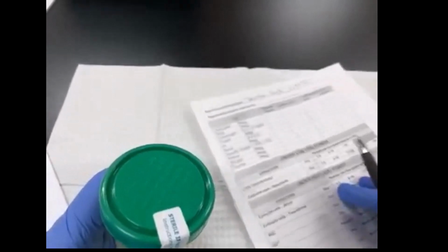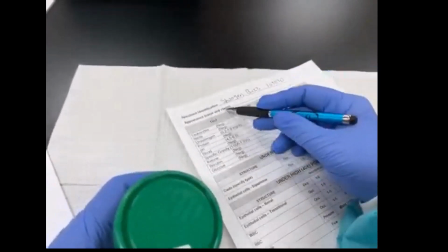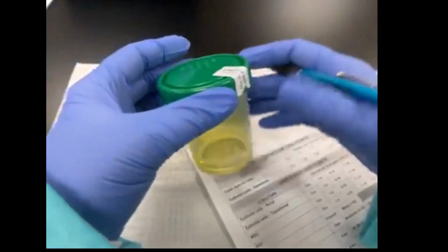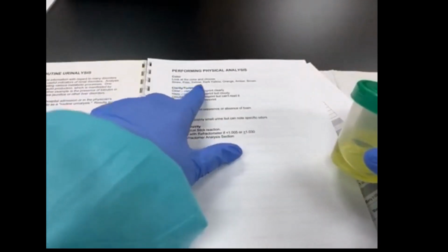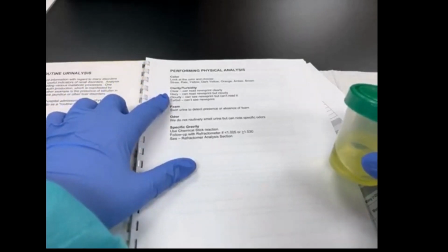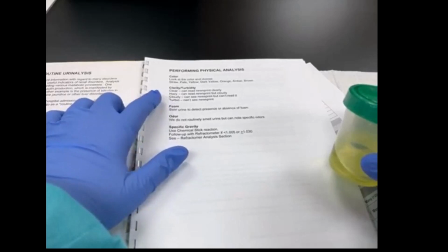So when we're looking at our paperwork, you see up on the top, you have the appearance, color, and clarity. So I'm going to look at the urine. And it is yellow. This one's a nice yellow color. If you look at the manual, it has up on the very top, it has information where you can write straw, pale yellow, dark yellow, orange, amber, or brown. Those are going to be the most common colors that we use. Once in a while, there may be something weird. That's okay. Once in a while, you might see a green urine. That's okay. When you're dealing with clarity: clear, hazy, cloudy, and turbid. Those are the ones we use.